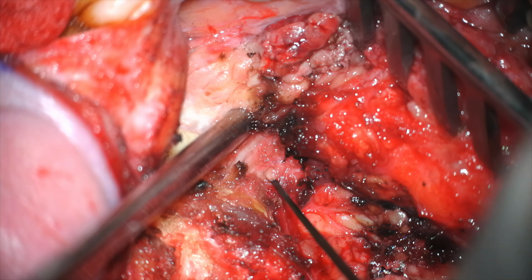Now you're going to sit down, and the first thing you're going to do is bipolar this artery and take it. Okay? Bipolar, I'm going to show you something. Don't bipolar it here, because then you're going to have all this tissue in your way. Bipolar it here, but everyone's afraid to do that because they're afraid the nerve's here. But you know that the nerve's not here. So you're going to bipolar and pull away like this. Now, didn't I tell you the nerve is going to be in that direction?